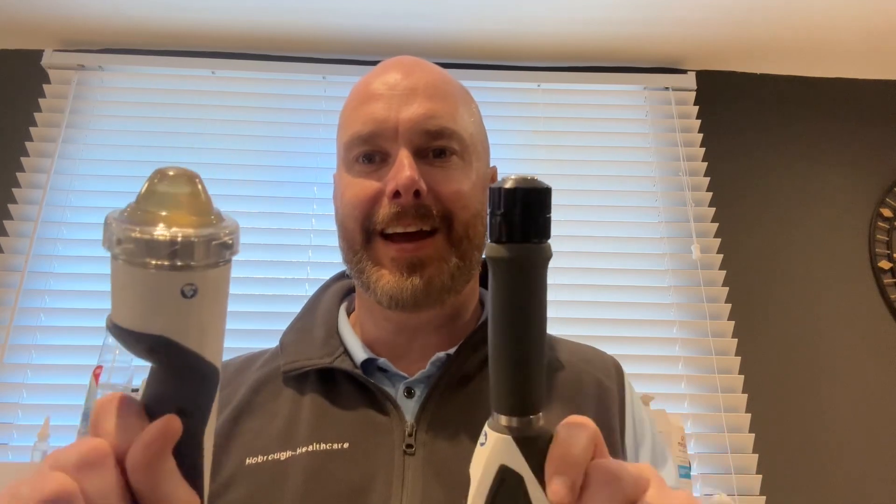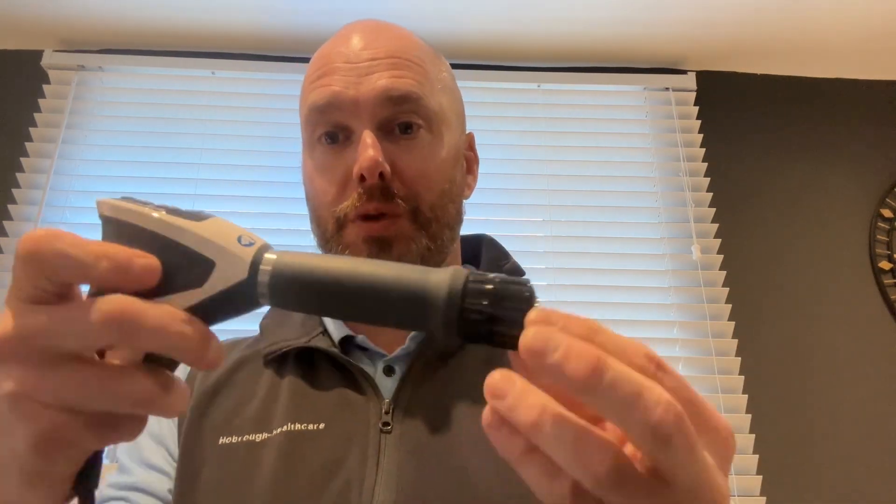Hello Shockwave enthusiasts, it's Paul Hobara here. I'm going to talk about frozen shoulder and the use of these two pieces of equipment. Many of you will only have the radial device. What you want to think about is how you're going to use the applicator head.